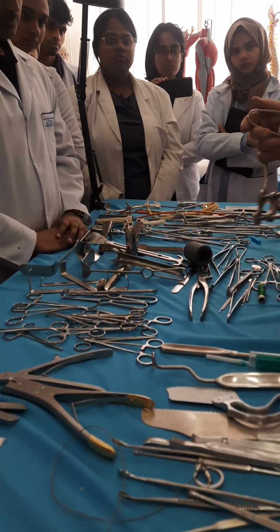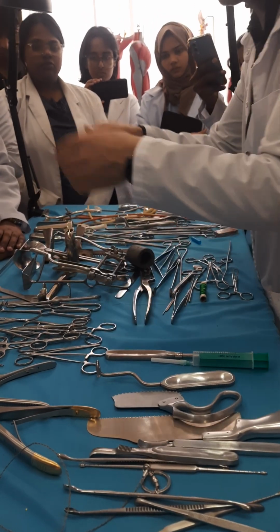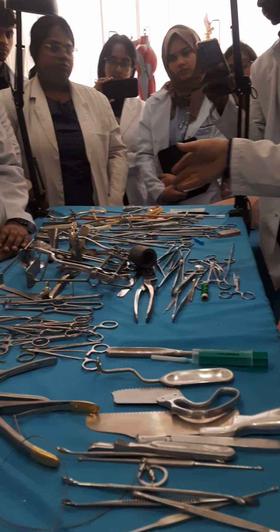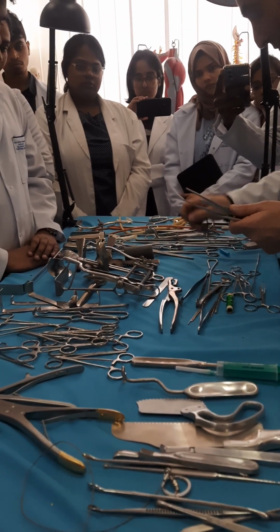That's an automatical Mikulicz or Gosset type of the retractors. Much better from that point of view. Why? Because you apply and you work. Nobody needs to apply it and to fix it. Okay, next instruments which I want to show, it is the dissecting forceps.